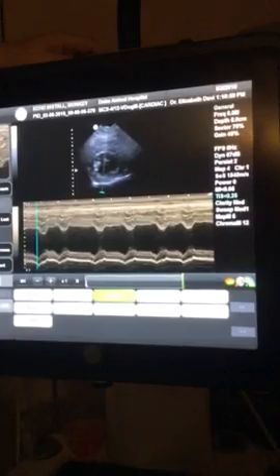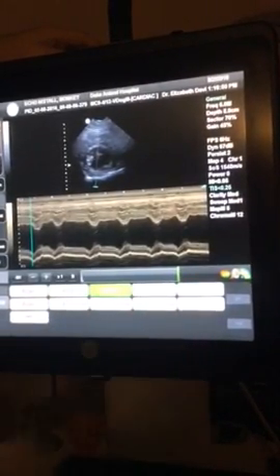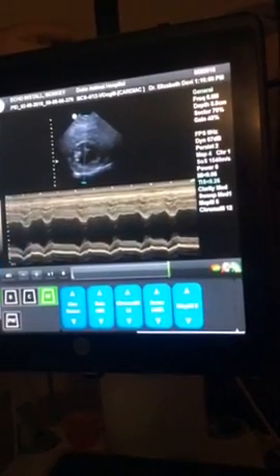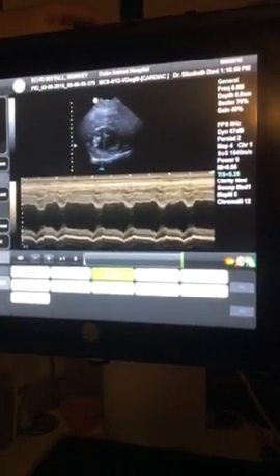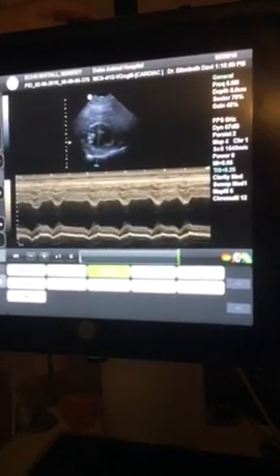So if those said 3, 3, 3, now I take a picture? You always take a picture to lock your images in. And then you would just say close. And then you would close, yes. And I get confused between close and report. Yeah, report would be only when you're in your ruler and the report button above number 1. That will open up your actual report page.